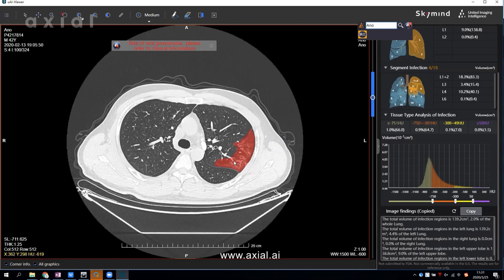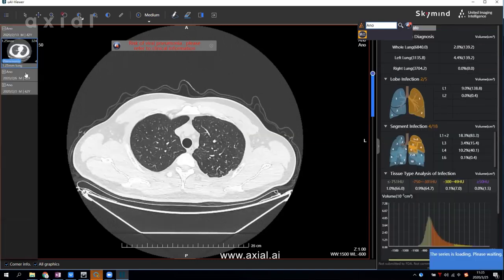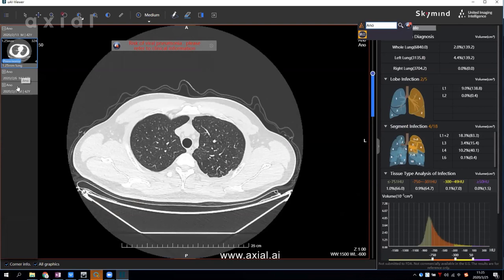Next is the follow-up feature. This feature is very important for doctors to check the previous study and to track the treatment progress. If you click the recorded report, it will show all reports previously analyzed by Axial AI.